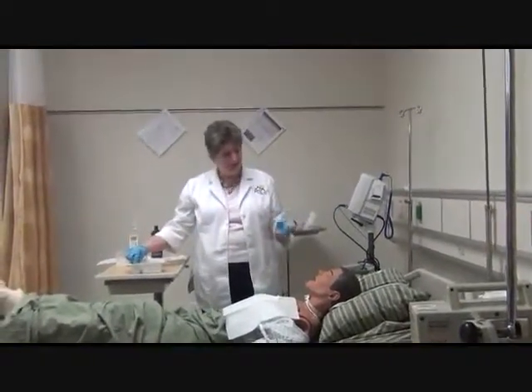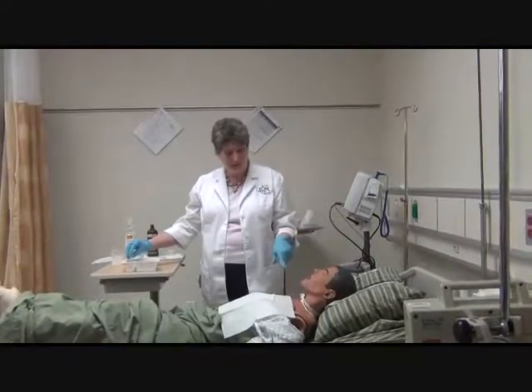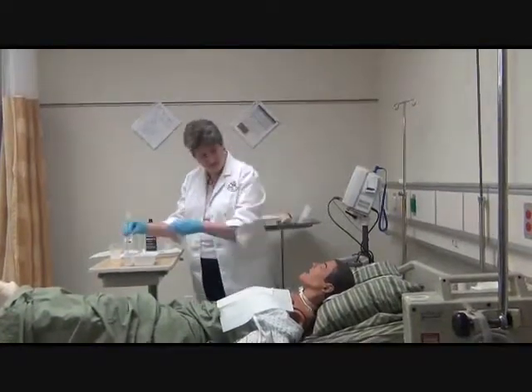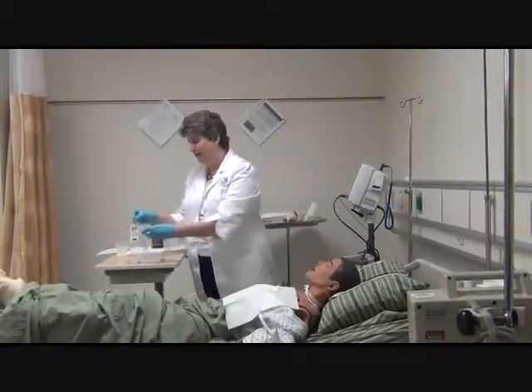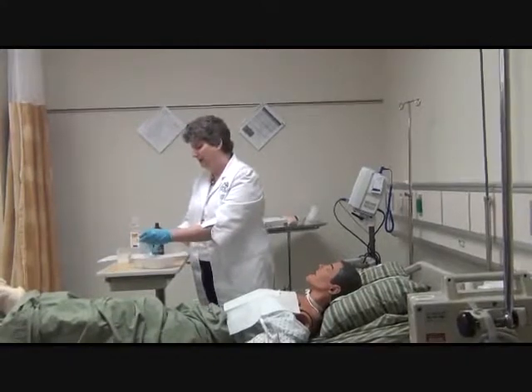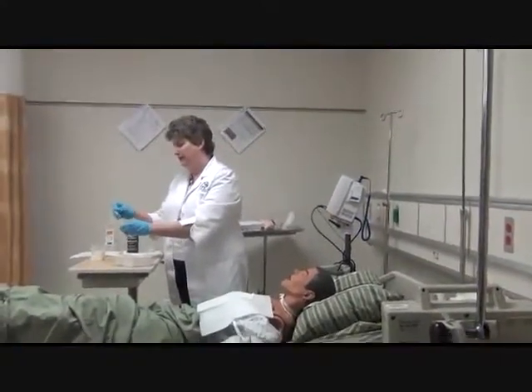At this point, he's looking pretty good. I've assessed his skin around the stoma, and you will describe that and document it. I now have the hydrogen peroxide, and I'm going to wash and clean the trach.